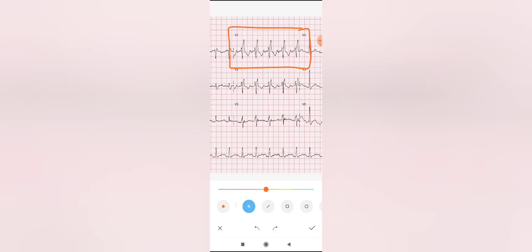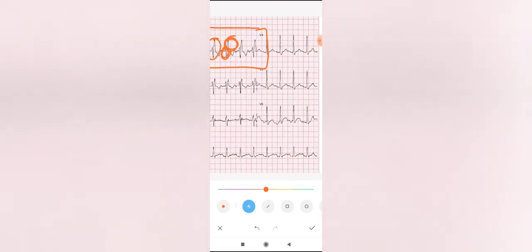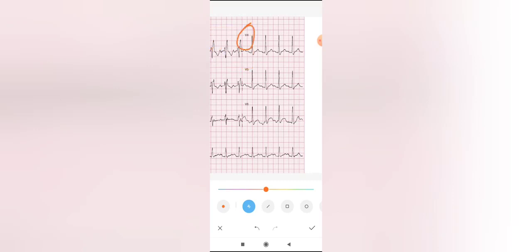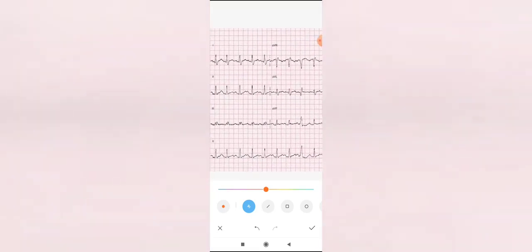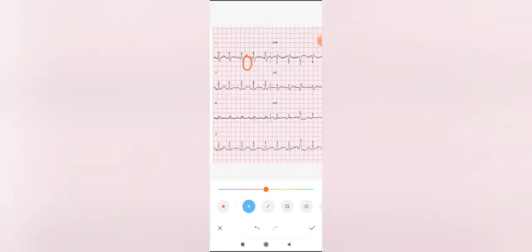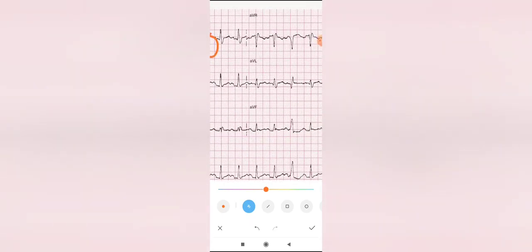In textbooks, the RSR' complex is described as the 'rabbit ears.' The first deflection is the left ear and the second is the right ear of the rabbit. Characteristically in right bundle branch block, the right rabbit ear is taller than the left. In lateral leads V4, V5, V6 and in leads I and aVL, slurring of the S wave is also appreciated.